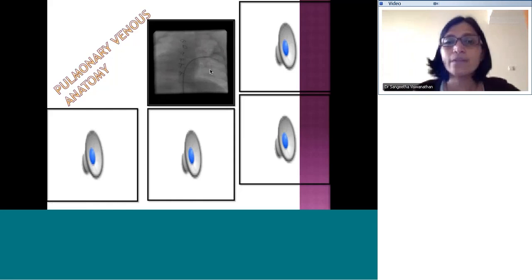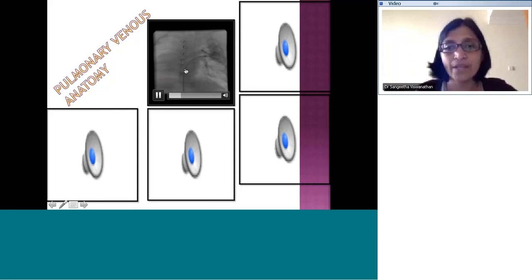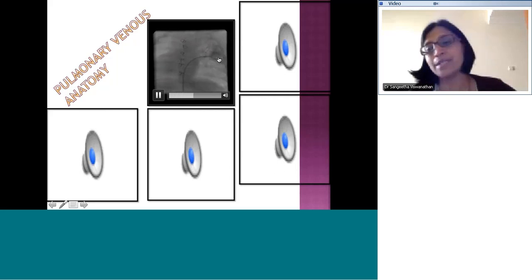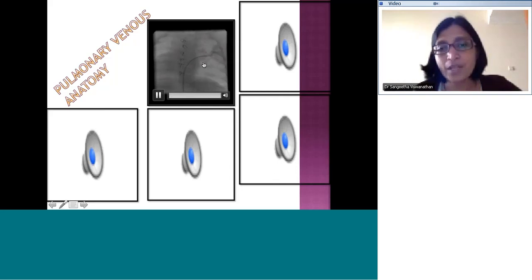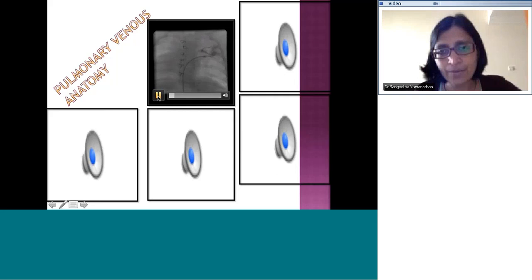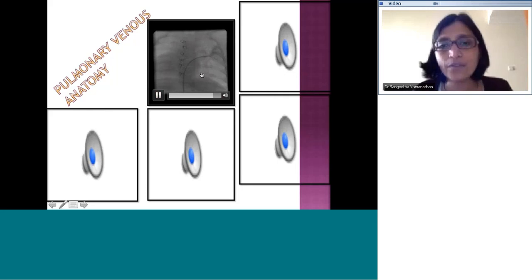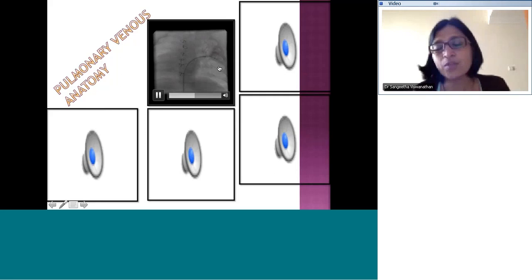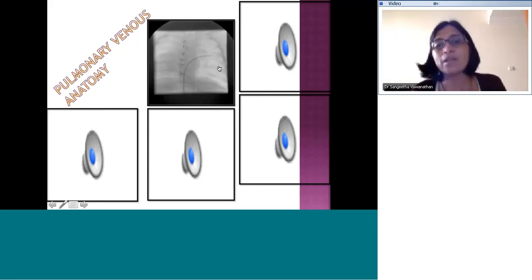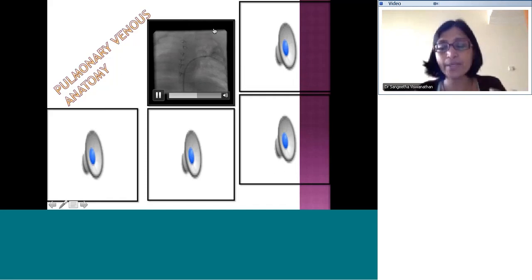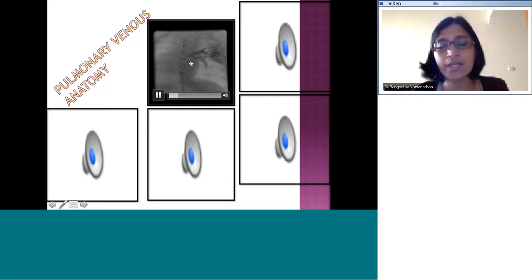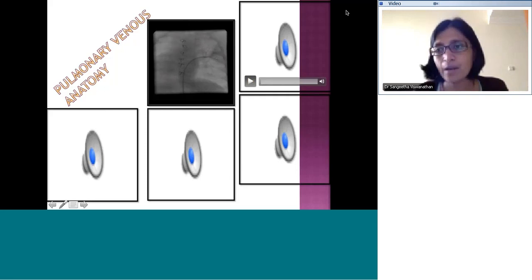Here, the catheter is directly engaged in the pulmonary vein, wedged and used to delineate the pulmonary artery. If you look at the initial phases, the catheter is inside the pulmonary vein, then it back-fills the pulmonary artery because it is wedged. If there is a PFO or atrial opening, it is possible to directly engage the pulmonary vein. This has been done in plain frontal. You can see this patient has dextrocardia and appears to be a post-operative patient.